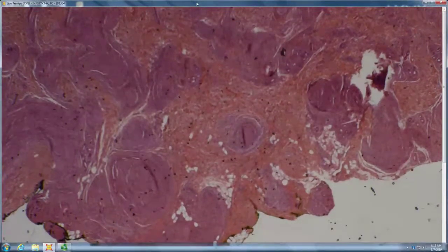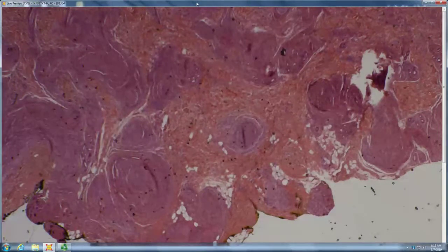You want to be very careful when you make that diagnosis. Make sure it has the neurofilaments in it the way you'd expect, like a neurofibroma, because when you make that diagnosis, you're essentially labeling someone with von Recklinghausen's.